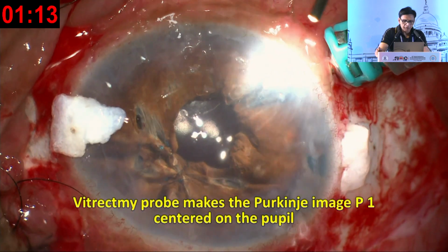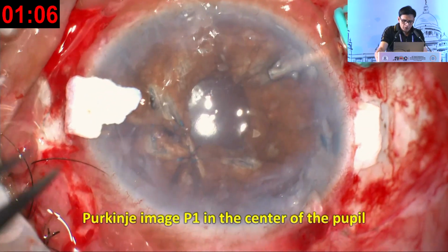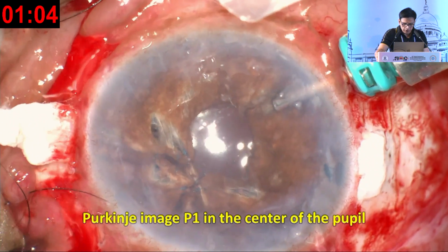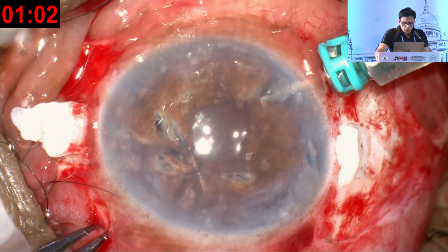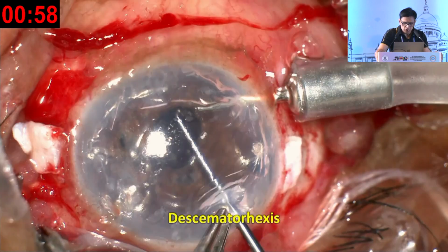Okay, so look carefully. That's the P1 in the center. The one inverted is the P4 image. Don't concentrate on the P4 image. Once you have done that, now I can go in and shift to air. So all I will do is shift to air, and just for completion's sake, I'll show you.